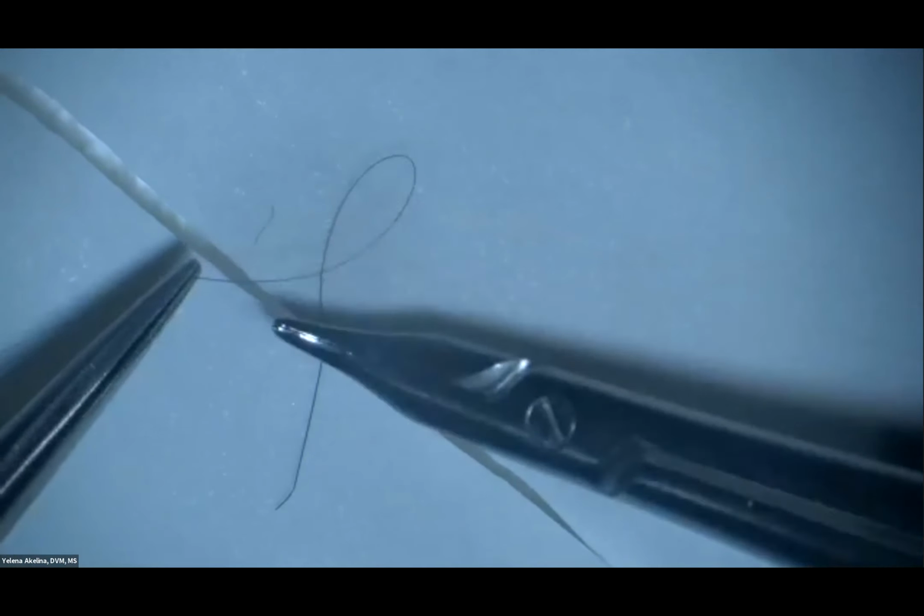As soon as the tissue meets, you stop pushing it together. I'm using the big loop so the instrument moves around it without disturbing your anastomotic site. Three square knots, that's all it takes.